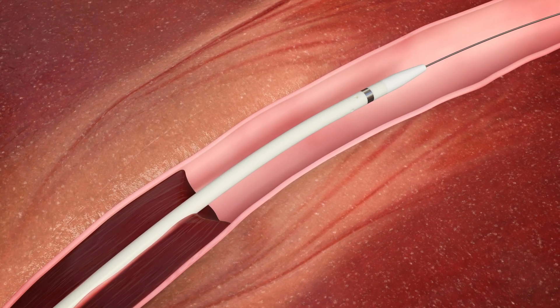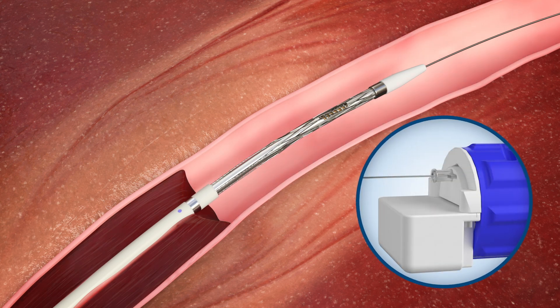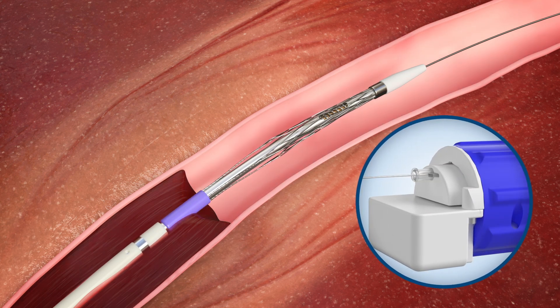Once the device is in position, the basket is unsheathed and then deployed by turning the dial on the handle, actively expanding the basket to provide wall-to-wall contact.